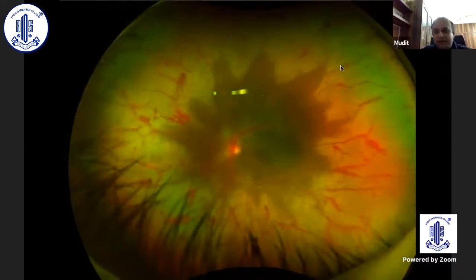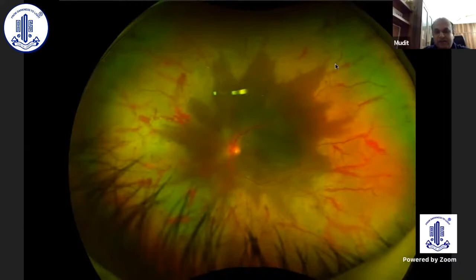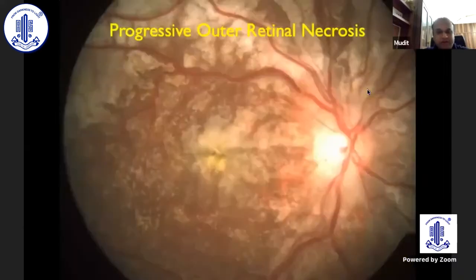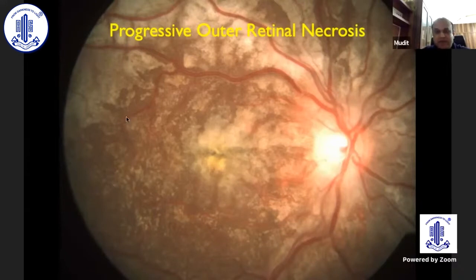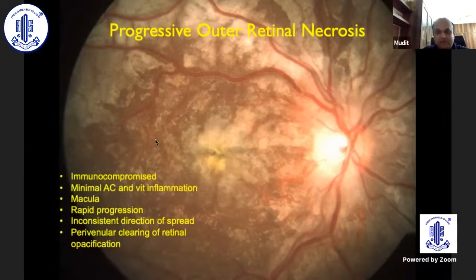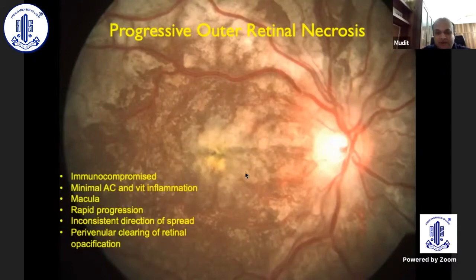Here is another patient of ARN showing extensive peripheral retinitis lesions with areas of occlusive vascular involvement. When you see a patient with a broken-mud sort of appearance — extensive areas of retinitis with some perivascular sparing in an immunocompromised patient — think progressive outer retinal necrosis (PORN). Key features: immunocompromised individual, minimal anterior chamber or vitreous inflammation, macular involvement, rapid progression, and the broken-mud appearance.